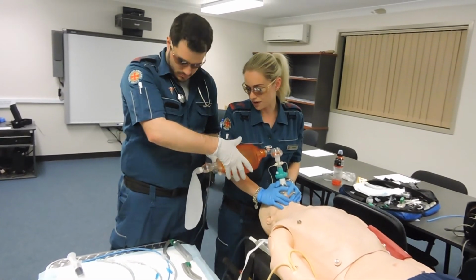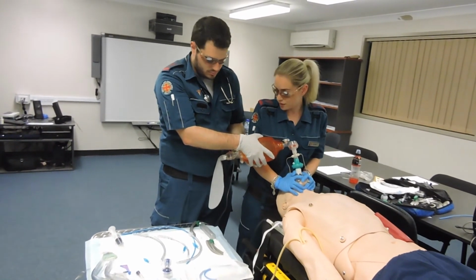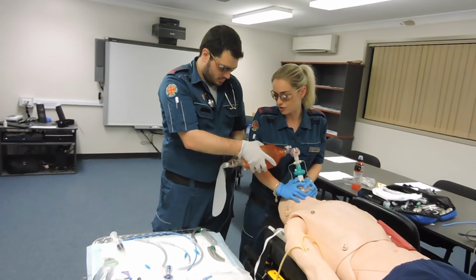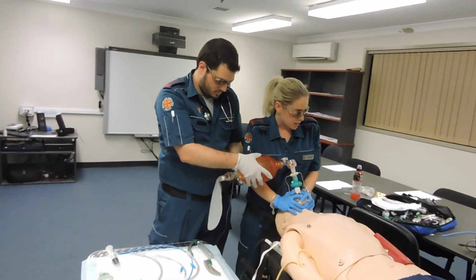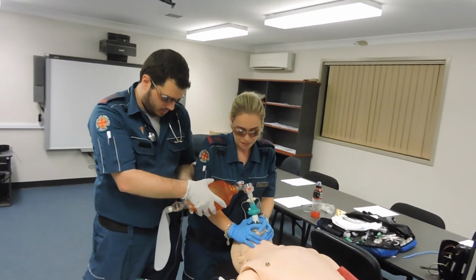Now Ben, what we're going to do is I'm going to have one more attempt. I'm going to use the size 7 again. I'm going to do laryngoscopy. You're going to pass me the bougie and then you're going to railroad the tube over for me. Yep. Now we've got our SpO2 back up to 98% and we're going to attempt this now, okay? Okay. Yep.